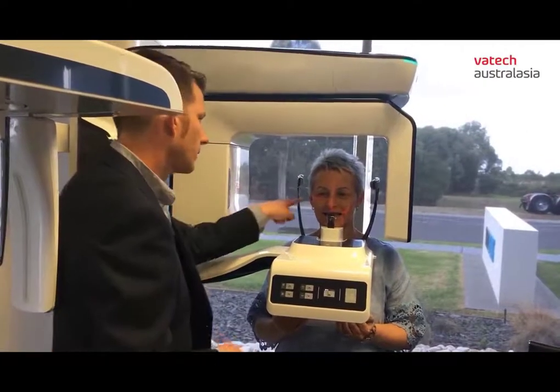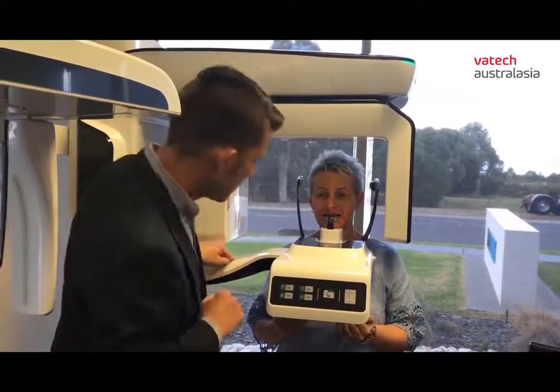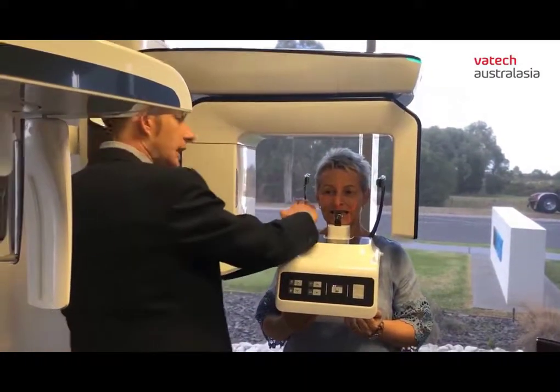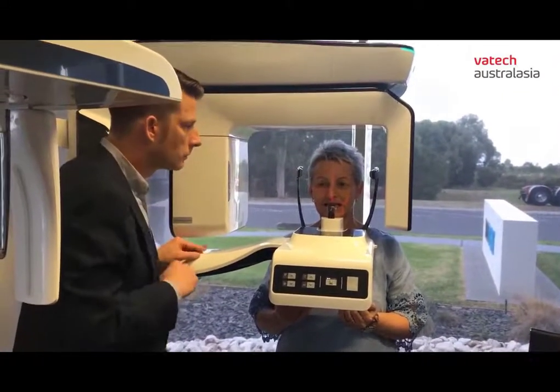So now I can see the line on her is going to be right here, right to the infraorbital notch of the eye. When she smiles, we can see the occlusion slightly tip down, about a 10-degree angle tip down. That's going to give us the pano with that nice smile on there.